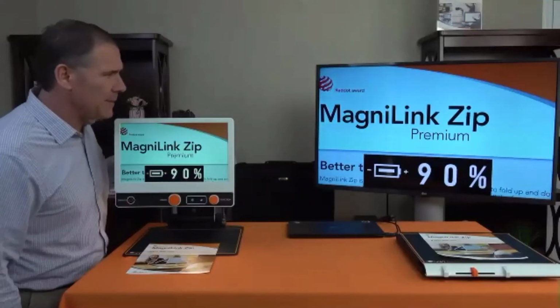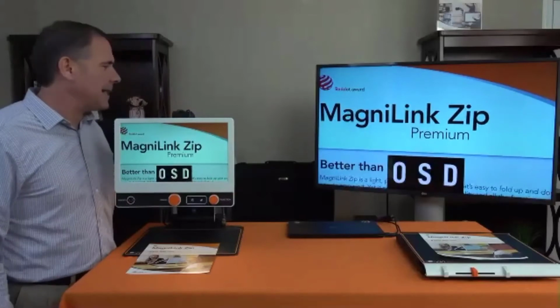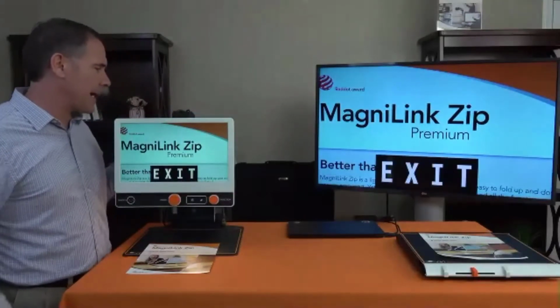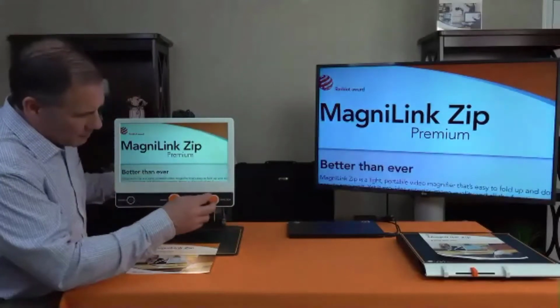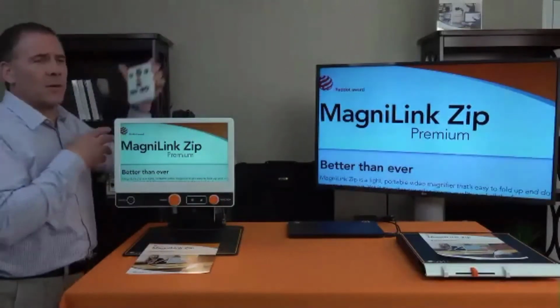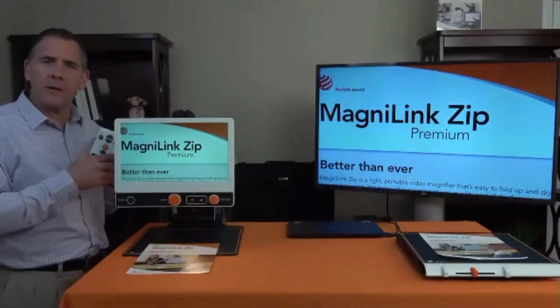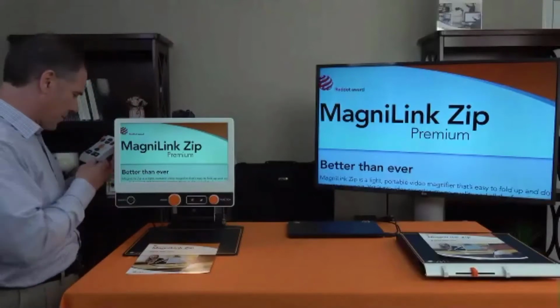That's telling me what's in the battery. I think it says 90. And on screen, the display language you can change. And then back to exit, and I hit the button. Now, I'm doing this all with this button right here. But since I have this keypad, which I love, I don't have to be out here. I can be over here showing you the unit with this. I mean, there's many more functions for this, but it's working for me now.